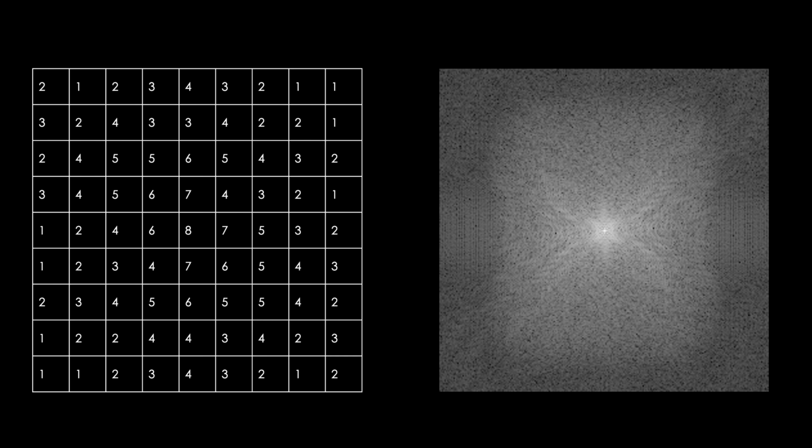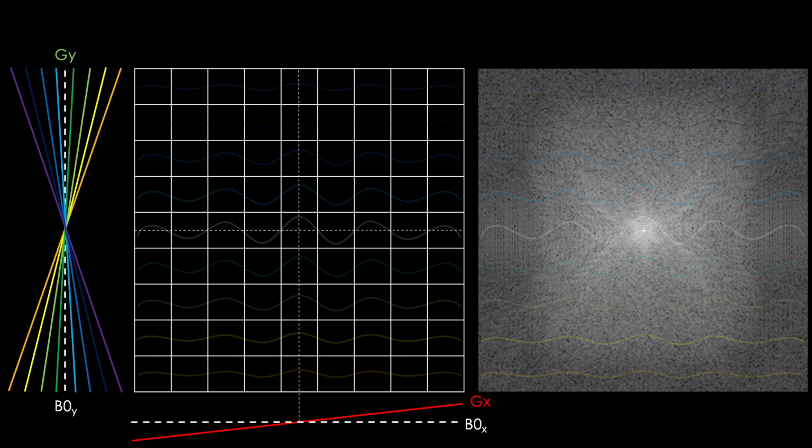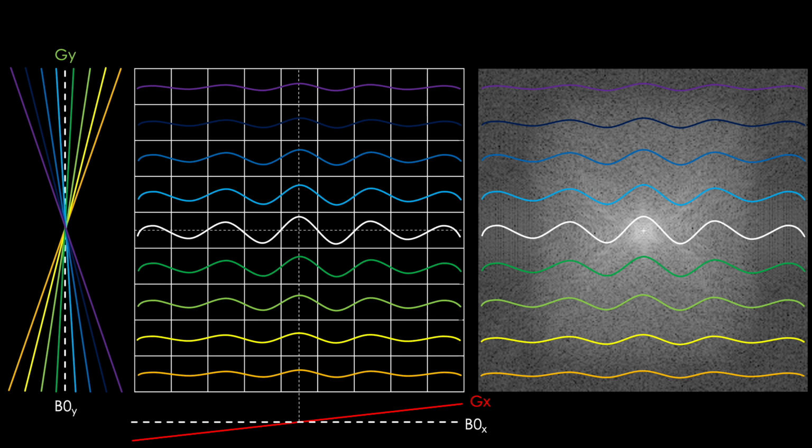Dun dun dun! The infamous K-space image. Notice the obvious. This is not our MRI image. We have not performed the inverse Fourier transform on this data to create an image. It's simply showing a correlation between the gradient fields we applied and the strength of our recorded signal, the echo.